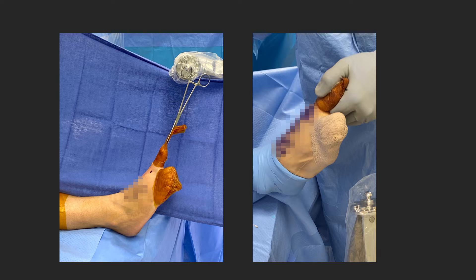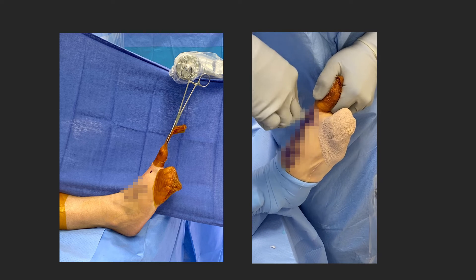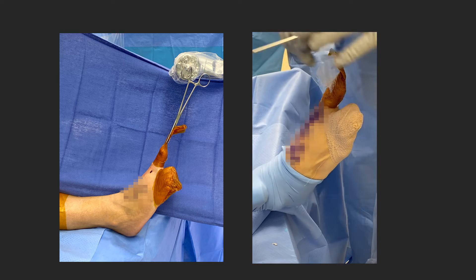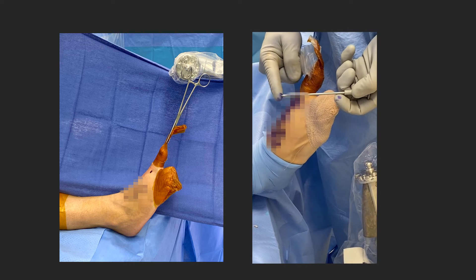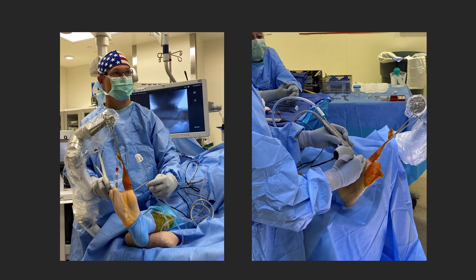We use an IO band around the toe draped over the tremano to give us distraction. Then we establish our dorsomedial and dorsolateral portals using nick and spread. What's really nice about using Nano is its blunt tip, which allows you to enter the joint very safely — important given how small the metatarsophalangeal joint is. The tremano holds good distraction, allowing me to use both hands freely.